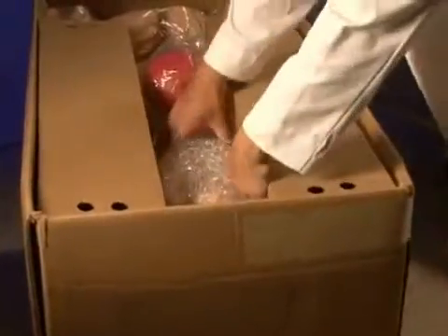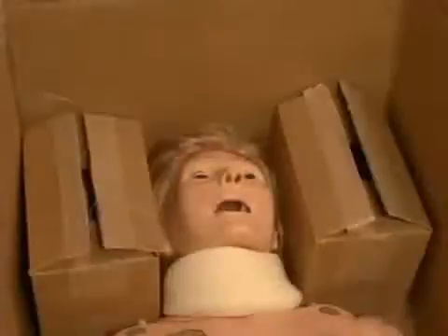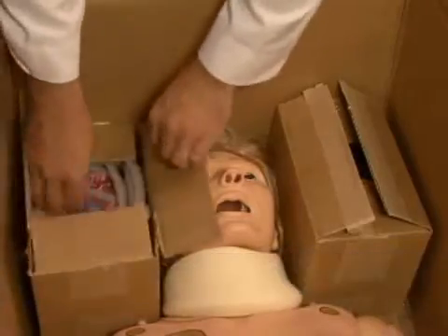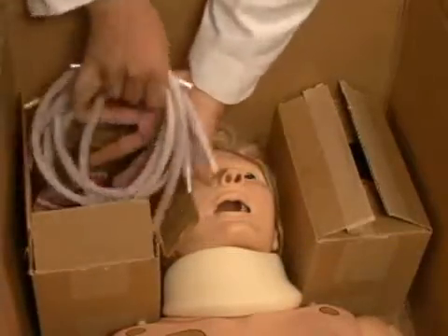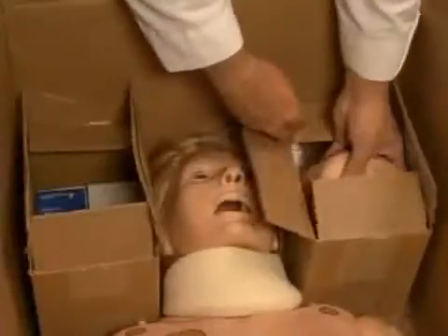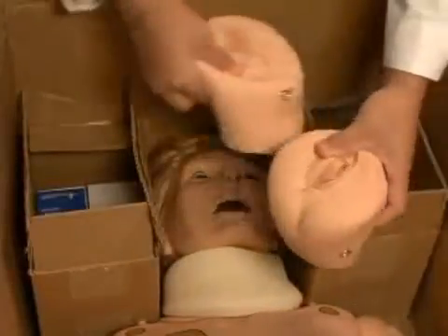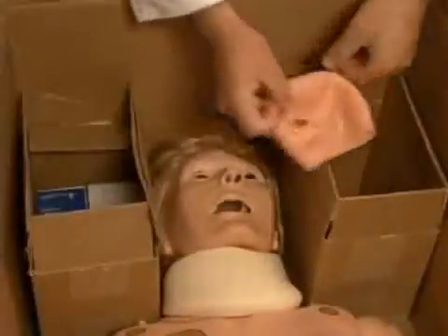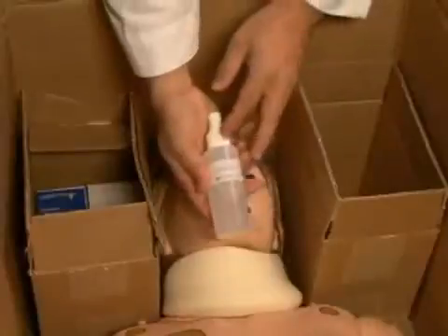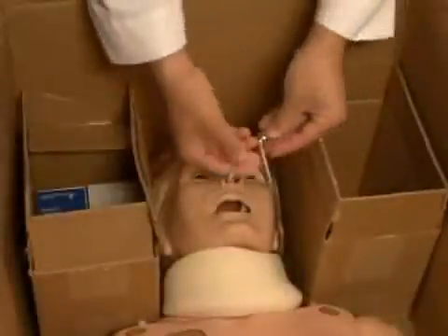Located in the NOEL mannequin box, you will find an articulating 28-week birthing fetus covered with bubble wrap and a postpartum uterine assembly. Next to NOEL's head, you will find two small boxes that contain other accessories, including umbilical cords, placentas, episiotomy kits, neonate head cover, silicone lubricant, and allen wrenches.